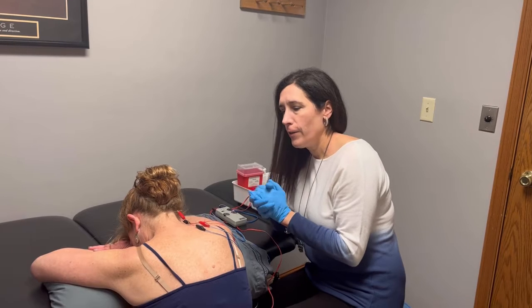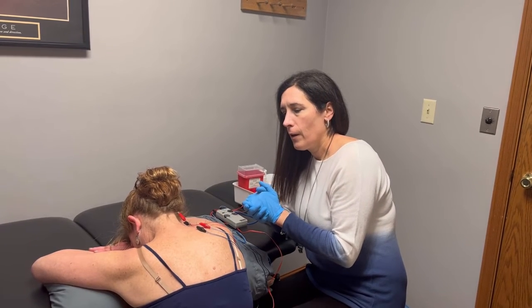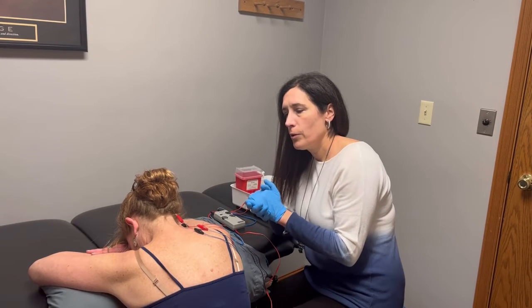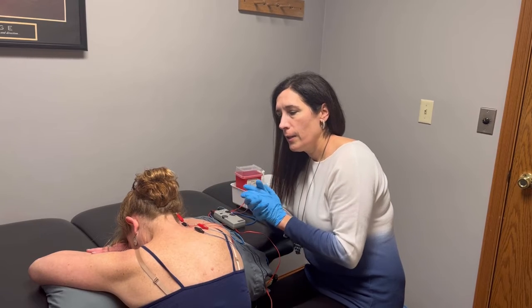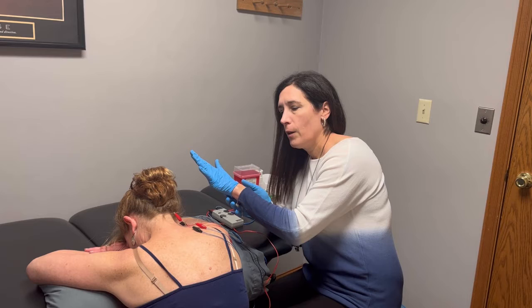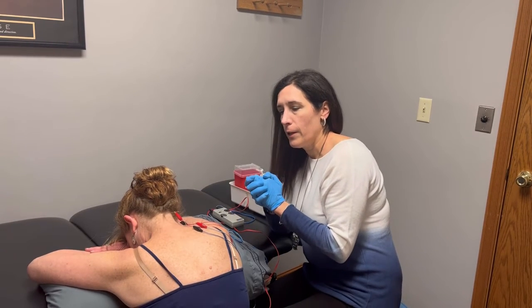So it's just a fine filament needle. I used 1-inch needles on Patty today, and we just insert them into the skin and into the soft tissue. By making this micro lesion into the soft tissue, the idea is that it sends a signal to the brain, which helps release nitric oxide to the body to help reduce the inflammation and the pain.